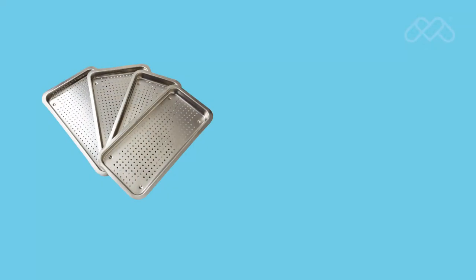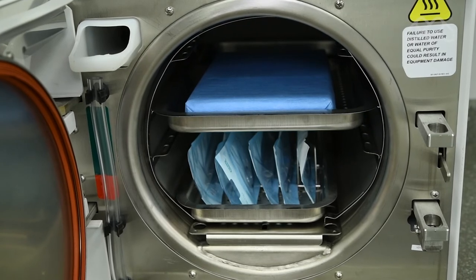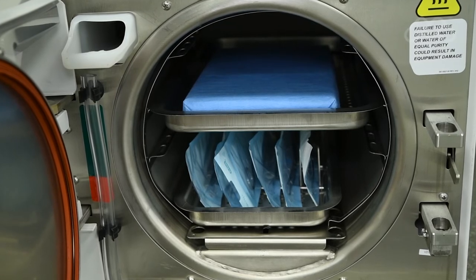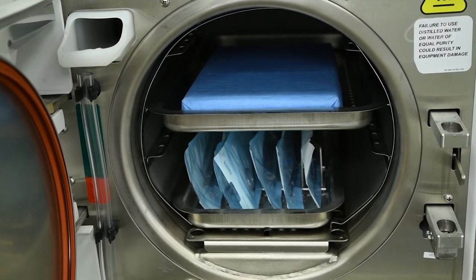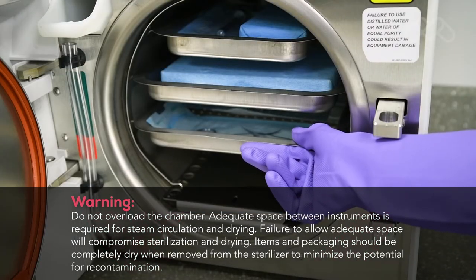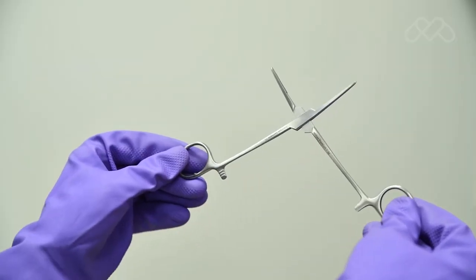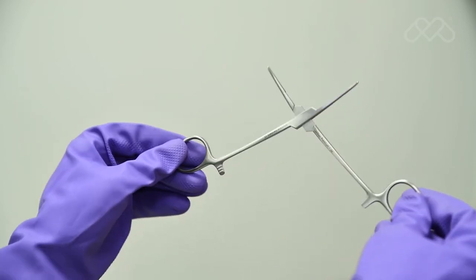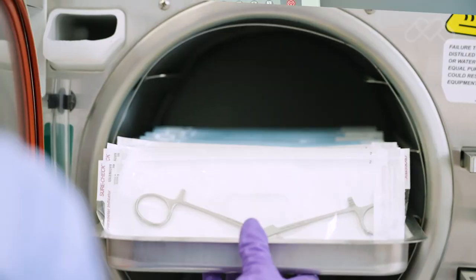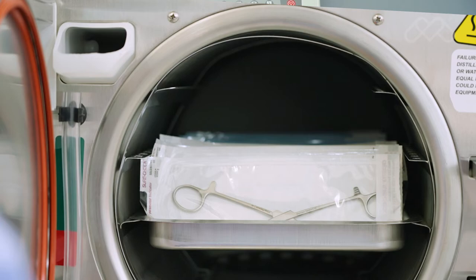Use only M9 and M11 trays and racks in their appropriate sterilizer. Using other trays or racks could restrict air and steam flow to items, resulting in inadequate sterilization and drying. All items must fit within the tray and not extend over the lip of the sterilizer tray. Instruments must not scrape the chamber walls when sliding the tray into the chamber. Jointed items must be sterilized in an open position, so all surfaces are exposed to the steam.